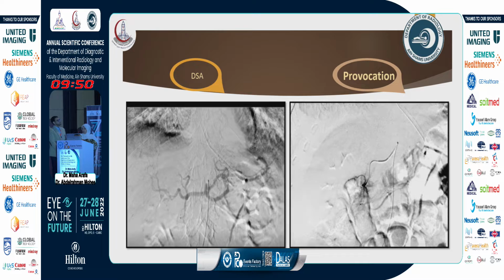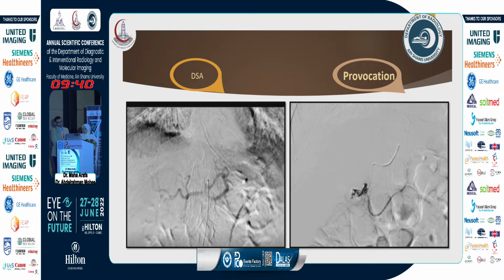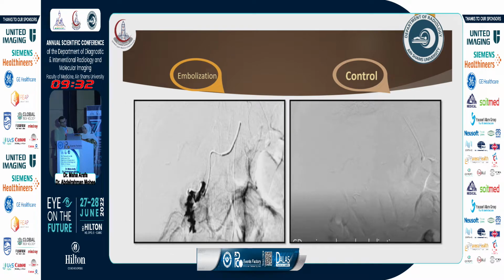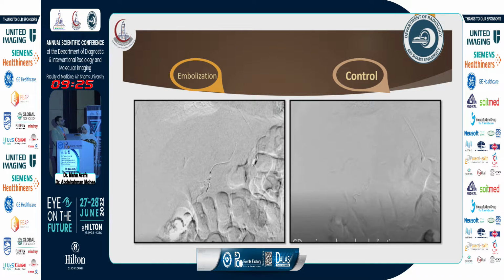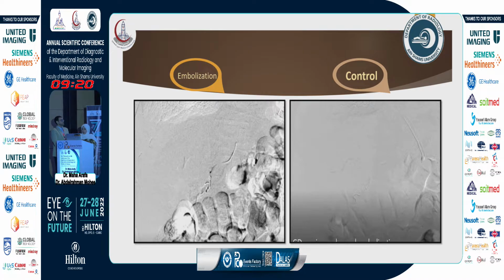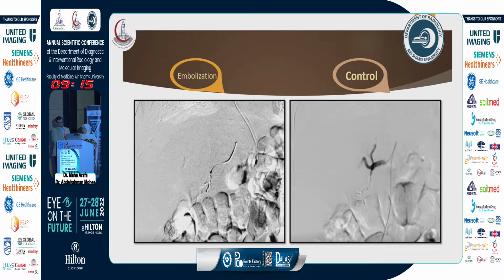So provocation angiography was done using 5,000 units of heparin and papaverine as a vasodilator, revealing marked duodenal extravasation. Anchoring of a microcoil at the bleeder in the gastroduodenal artery was done with cessation of bleeding. Control angiography revealed no more bleeding. The patient's condition was stabilized.